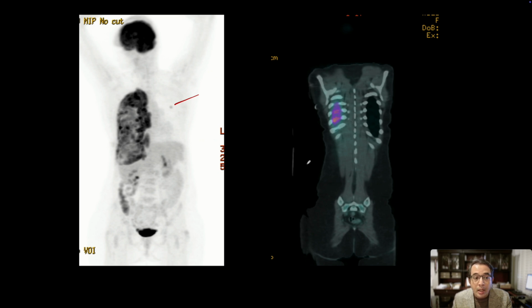So frequently the lung cancer can spread into the pleural space, and when that happens, there can be drop metastases, so the cells can drop in the pleural space from the superior to the inferior aspect of the pleural space, and then they will grow there, becoming tumors, and these tumors will be FDG avid. So when you see multifocal uptake in pleural masses, it is pleural metastases and not a mesothelioma, which shows diffuse thickening of the pleura with hypermetabolism.